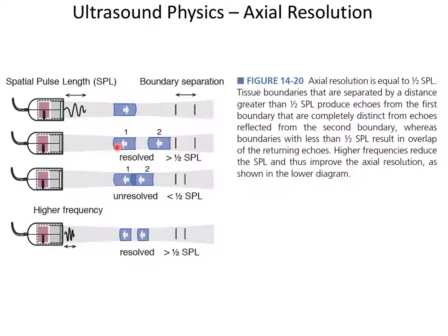When they come back, they're separable. So I will hear two separate echoes, like a bing bing, as it comes back to my transducer. So I go ping, bing, bing. Now those two echoes I know are different depths. The first echo is the shallow thing. The second echo is the deeper thing. Okay?